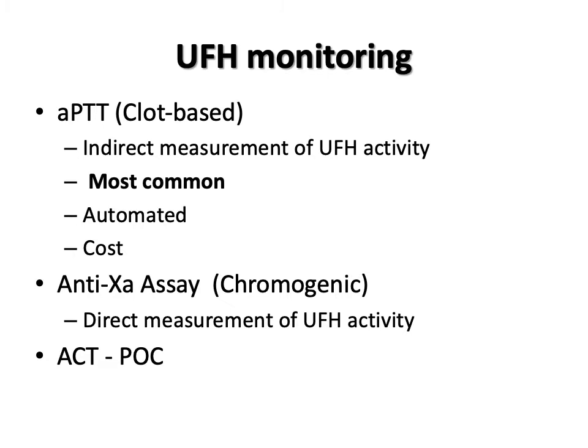The APTT, or simply the PTT, is the most common test used to monitor unfractionated heparin therapy. The PTT test is inexpensive, easy to run, and automated for faster turnaround times. A PTT should be run prior to starting therapy to get a baseline value and determine that the PTT is normal for the patient. If it is not, it could be due to lupus anticoagulant, an antiphospholipid antibody, or a factor inhibitor or factor deficiency.